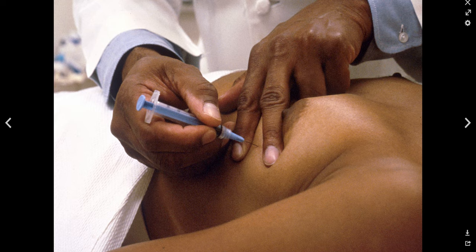So this is an example of a DIFQUIC stain and because you air dry it there is artifact where the cell's size artificially increase so it's important to know that.